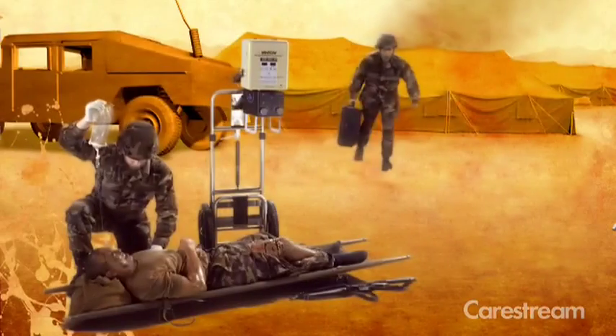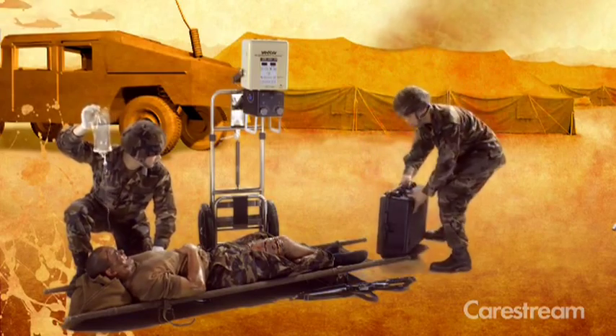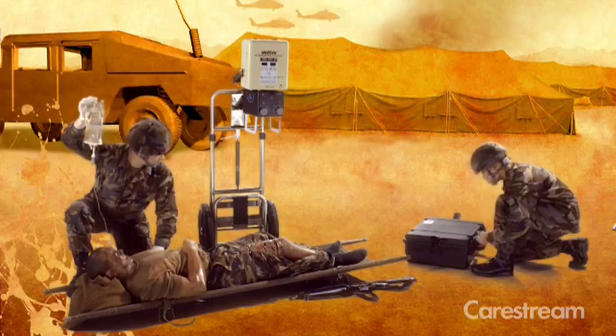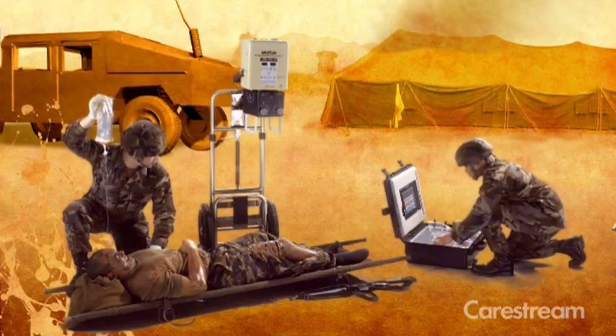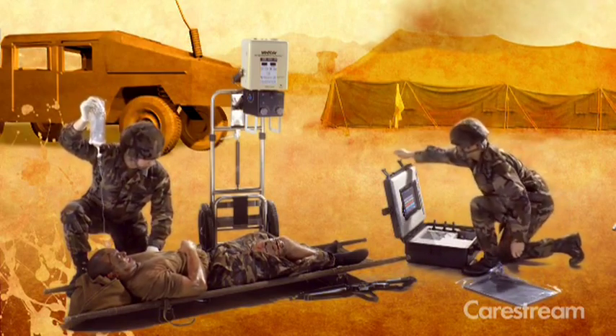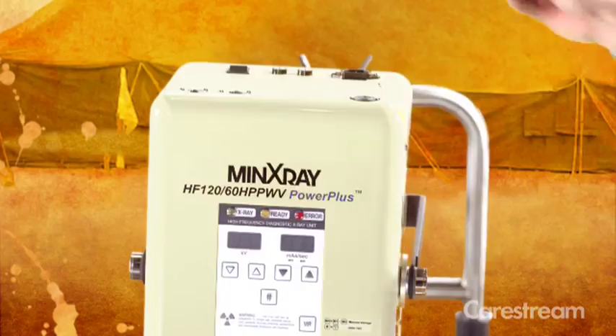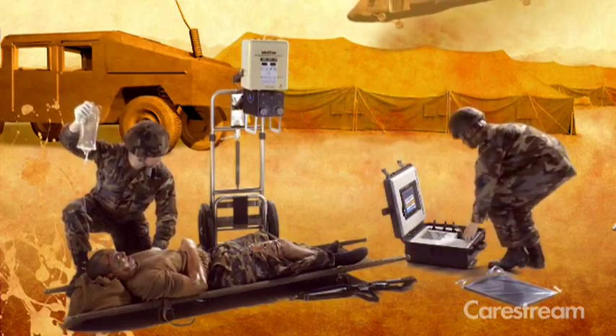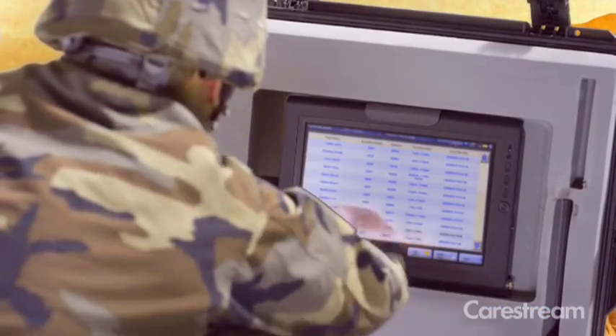The DRX transportable field unit is a rugged, all-in-one solution that gives you all the performance of a DR imaging room whenever and wherever you need it. Easily carried and installed to portable X-Ray generators, this compact system is suitable for harsh environments. The system includes a wireless detector, electronics, wireless access point, and a tablet PC.